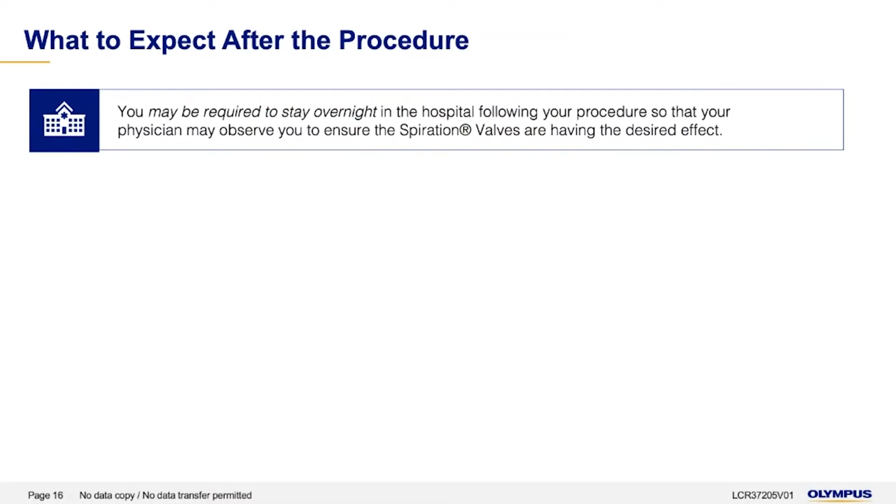If I collapse down the portion of your lung, if the valves do exactly what I want, then as that other part expands, the chance of it popping does happen, and it is a byproduct of the success of the valves. Thankfully, it's still a relatively low risk, though we wish it was zero, and it's obviously something to talk about with your doctor.